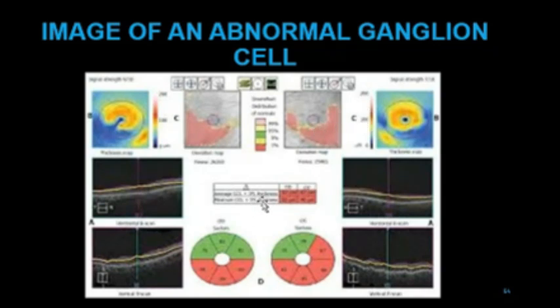And then when we come to this table here, everything here is red, right? Yes. But the previous one we saw earlier was green. So the red itself is an alarm telling you that something is wrong. Now, if you look at the pie chart here, you find out that this place is red, here is green. This place is red, here is green. So this red is showing a loss.